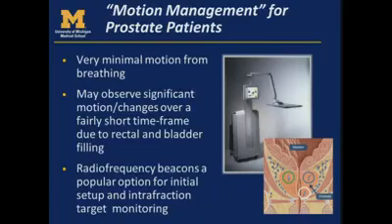So I put motion management here in quotes. Of course, we're going to see very minimal, if any, breathing motion in the prostate. However, there are a lot of other types of motion that you see.